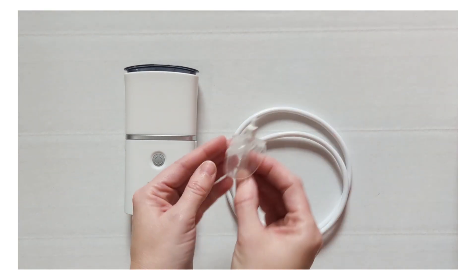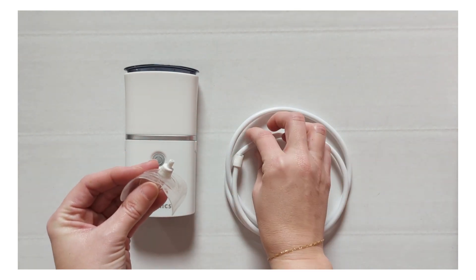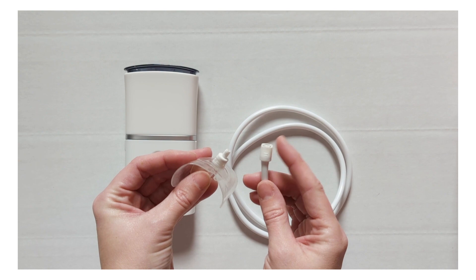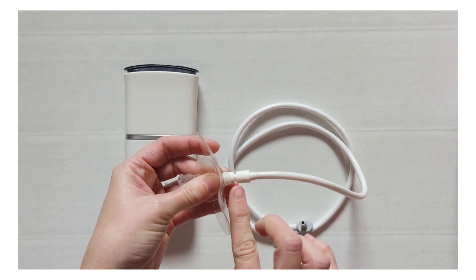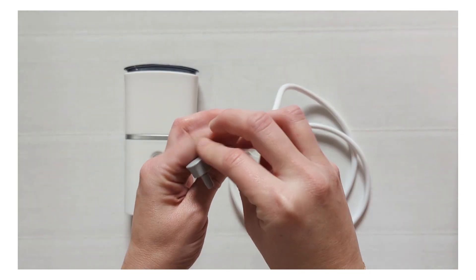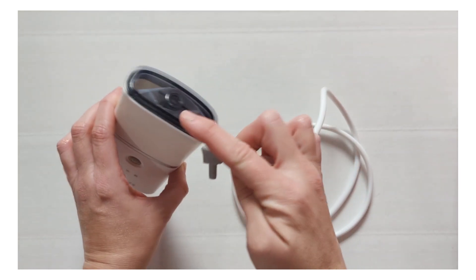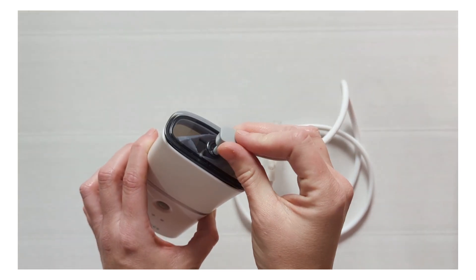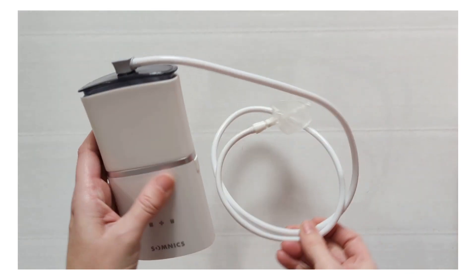Now take your oral interface and connect it to the tube on the white end. Make sure they line up correctly and that they snap together securely. Then take the gray end of the tube and place it in the small hole in the top of the device. Make sure it is secure and snaps in.